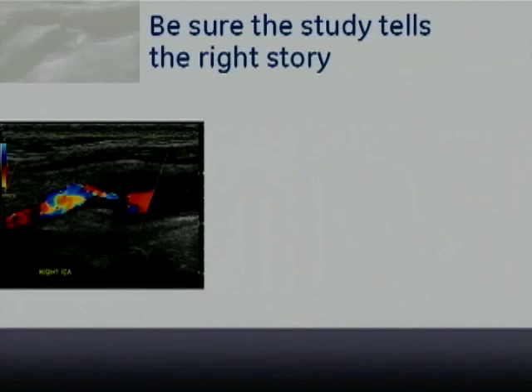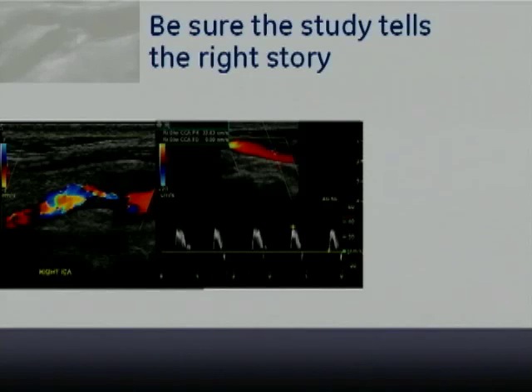And my first input to her just on this image, it looks like there is probably a high-grade stenosis, but there's too much aliasing. And if you look at the velocity scale, the numbers here are quite low, which means that the PRF is set too low. Velocity scale and PRF are two words for the same thing. It needs to be raised so that we can really appreciate some of the flow without all of the aliasing.